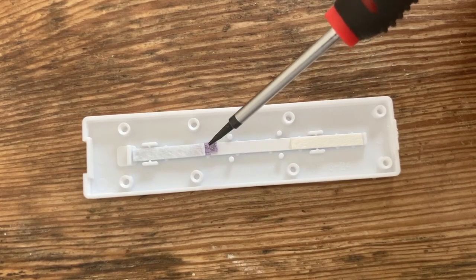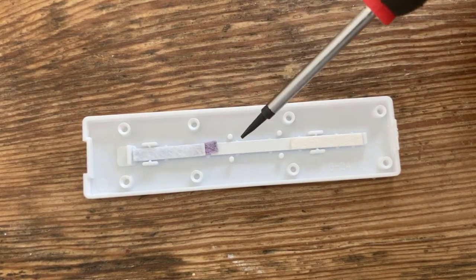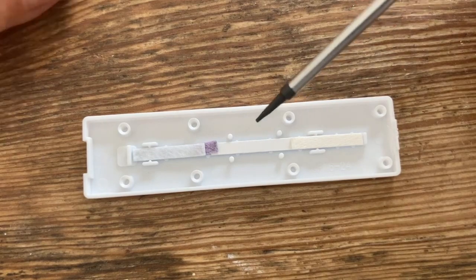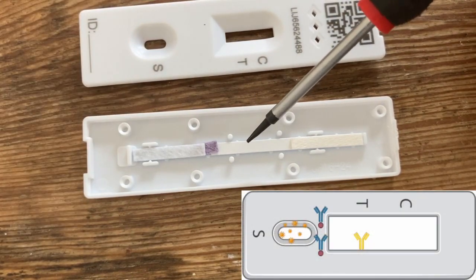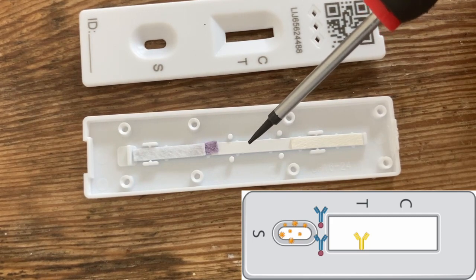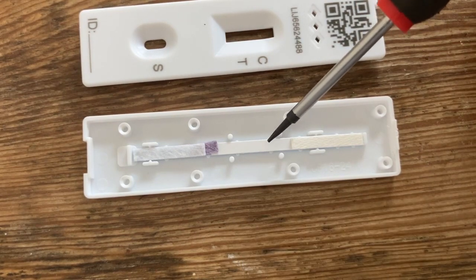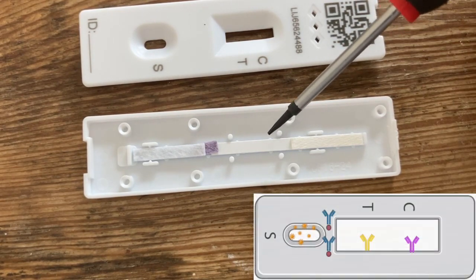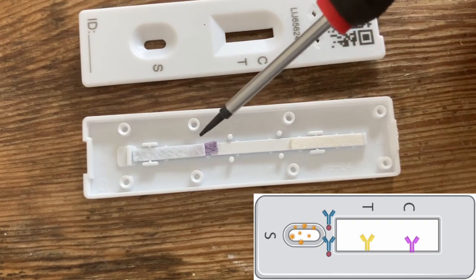There are antibodies labelled with gold particles and those antibodies bind to virus particles. Down here, roughly where the T line is, we've got the primary antibodies that bind to virus. And then here we've got a control line — these are secondary antibodies and they bind to the labelled antibody.